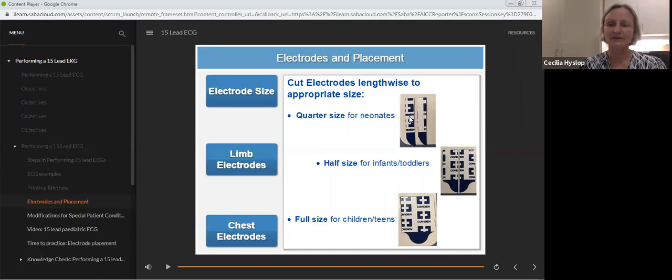And sometimes we have dressing. And many, many years ago, when there was a dressing, sometimes people used to move the stickers to the right of the dressing or to the left of the dressing. The problem with that is the cardiologist doesn't know that it's not over the area of the heart that they're supposed to be examining because they didn't watch you do it.